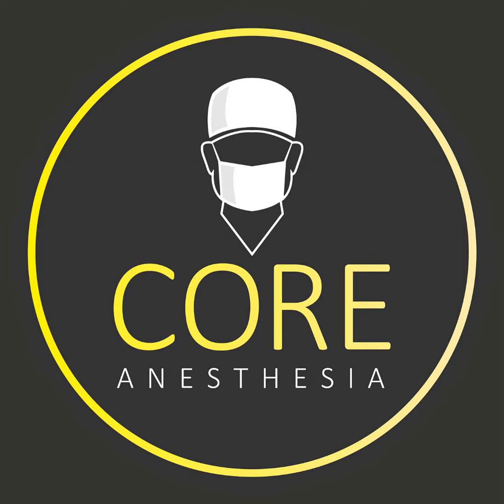That's a big difference when we're talking about preventing stroke and hypotension in this patient population. So you have to keep that in mind, that where we're taking this blood pressure cuff and where we're trying to protect, such as the brain, is taken into consideration.